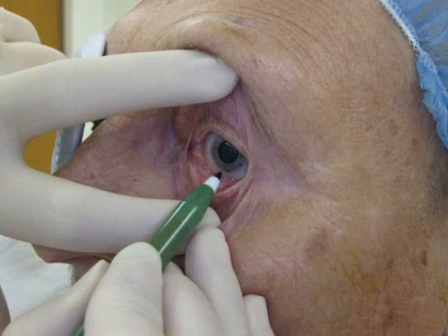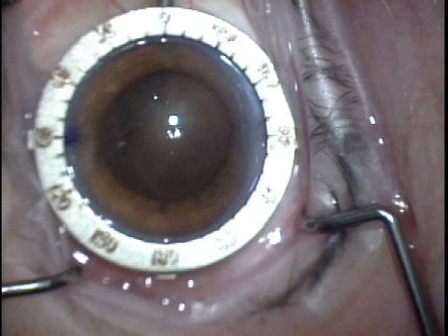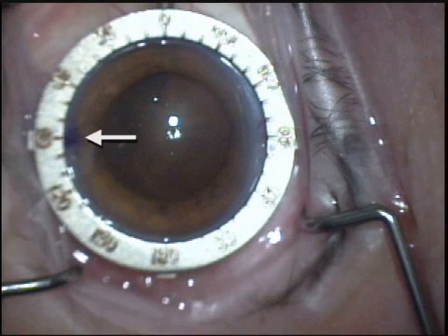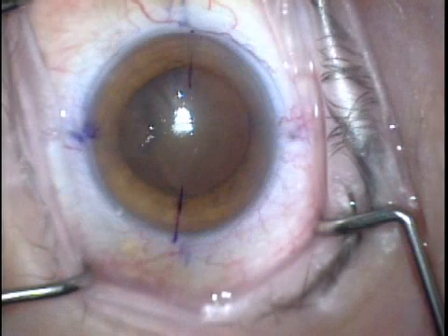First, a single dot is placed at the 6 o'clock limbus during the eye preparation with the patient upright. Next, the degree gauge is centered over the cornea with the vertical bar aligned on the dot. Finally, the half-circle marker is placed within the ring to create the lines that consistently lie directly over the correctly positioned toric lens.